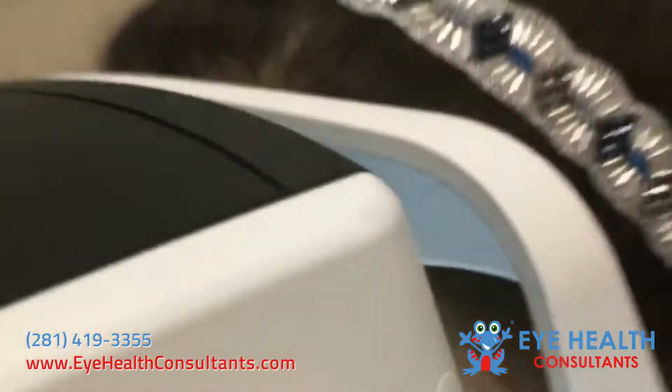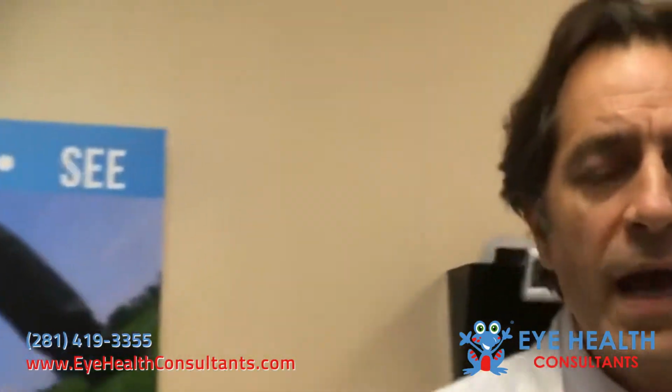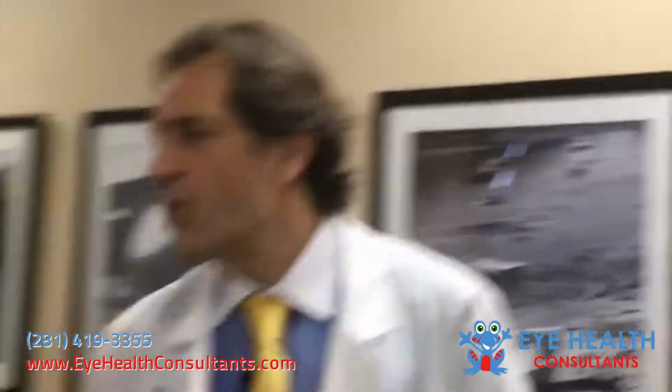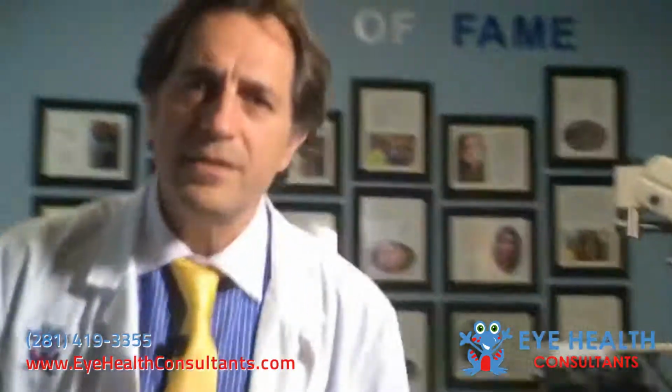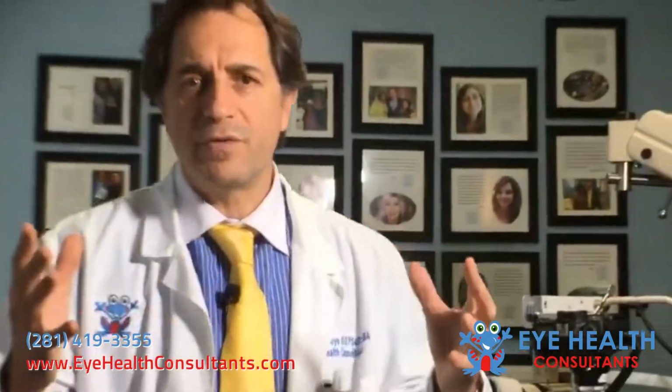So after we collect this information, we bring the patient to another room. And remember, this is an exam to evaluate candidacy for corneal molding. So after we've done that, then we are going to take something called a topography. And we capture an image of the corneal curvature. And that's very important because that corneal curvature is going to tell us whether the patient has good corneas that can be molded non-surgically. So that's what we're going to do now.